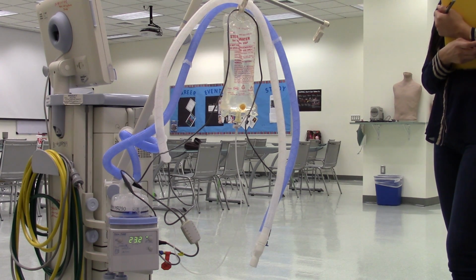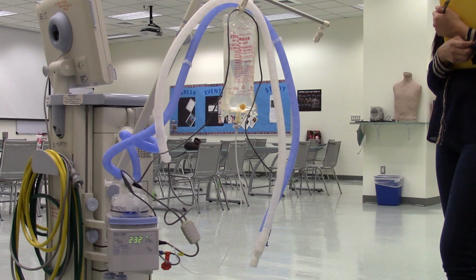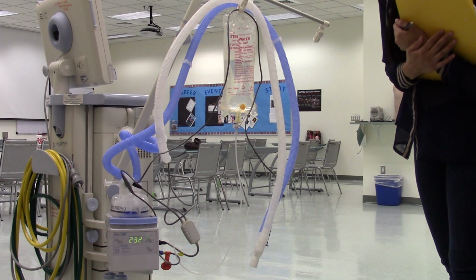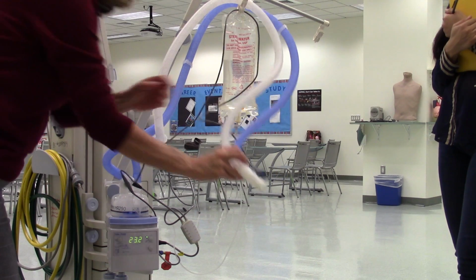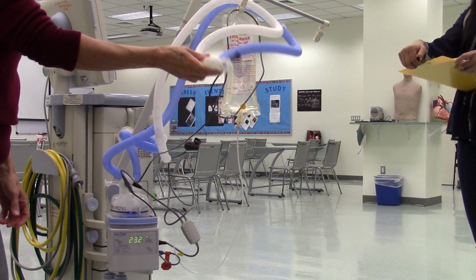I'm wondering, does it say 37 because it's telling us what it will be inside the patient? Or will it say 39? Usually I see 37 on these. Okay, but the temperature is 39 when it gets to the patient? It's 39 when it gets to the sensor, and probably 37 by the time it gets into the endotube. Okay.